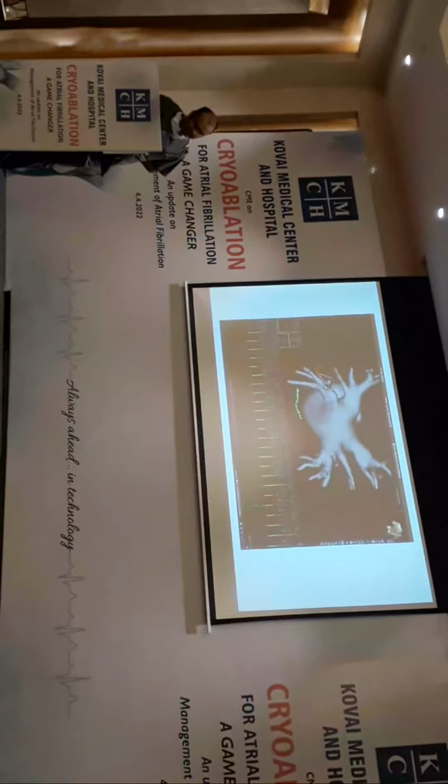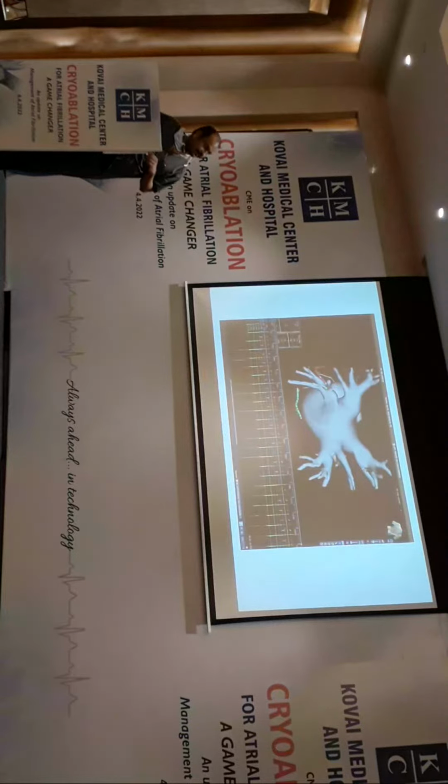So this is a magnified view. You can clearly see the pulmonary vein getting isolated. You can see our catheter, the mapping catheter, is in the pulmonary vein. My cryoballoon is here. So the cryoballoon is on the vein, and the mapping catheter is recording from the pulmonary vein. So when you isolate, there will be no conduction across the pulmonary vein into the left atrium.